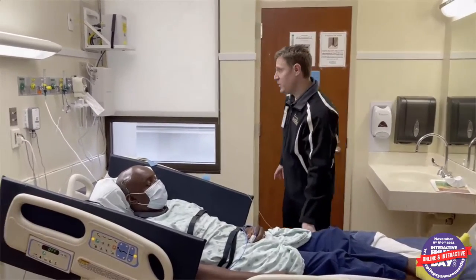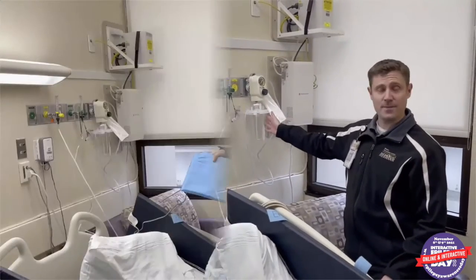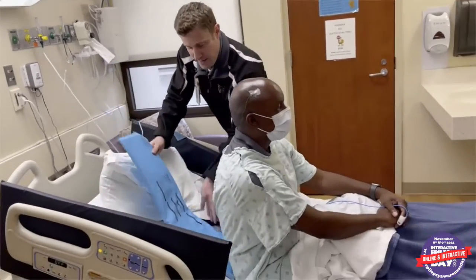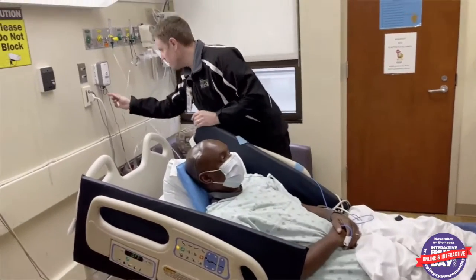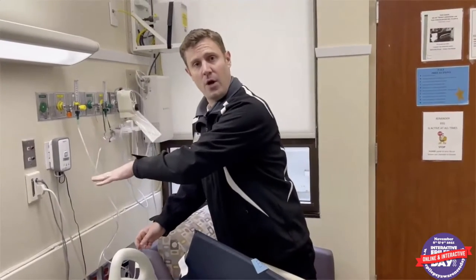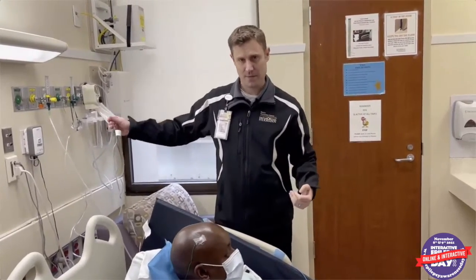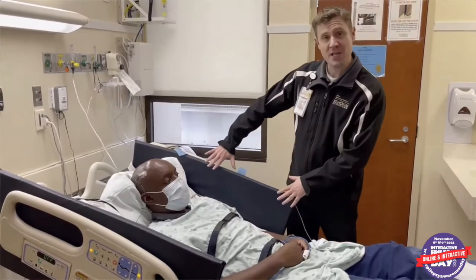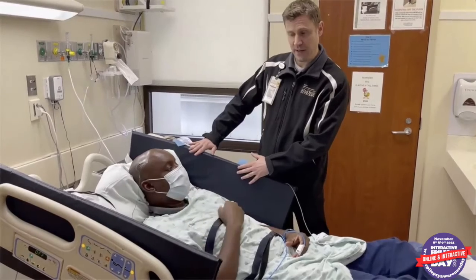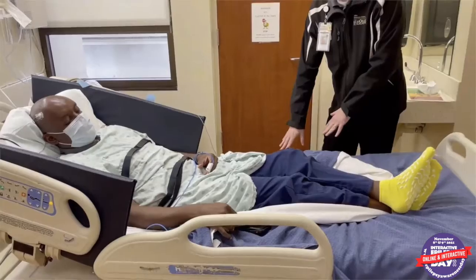As we go in the room, we can see we also have oxygen for the patient in case of a big convulsion seizure. For patient safety, we also use those pads that you can put on the patient's back that connect directly to a bed alarm system that we can connect right here. So whenever the patient tries to get up, the alarm would go off, and the nursing staff will accompany the patient from the bedside to make sure the patient is safe. To protect our patient during a seizure, we want to put those safety pads on each side in case of a convulsion. We like to put these sideways up just to prevent any safety issue, and then we have this one up as well. We try to keep one lower to give the patient some mobility.